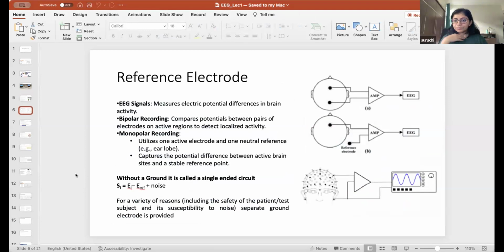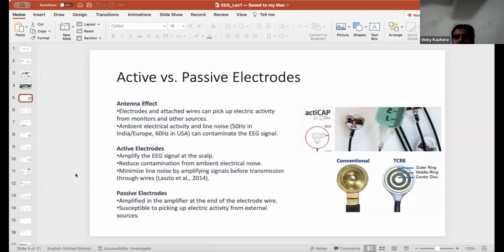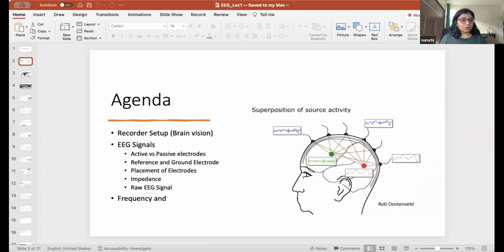Have you heard of them? Yes, ma'am. Ma'am, we have passive electrodes, right? That's why we use gel. What we have is passive electrodes. What Shilpi had was also passive electrodes. There's another confusing nomenclature, but do remember that when we have these kinds of montages, yes, ma'am.